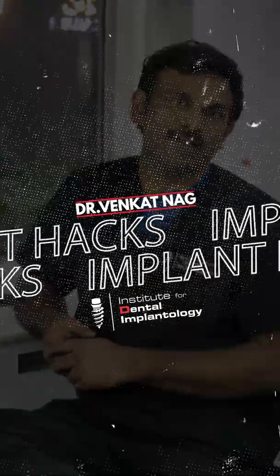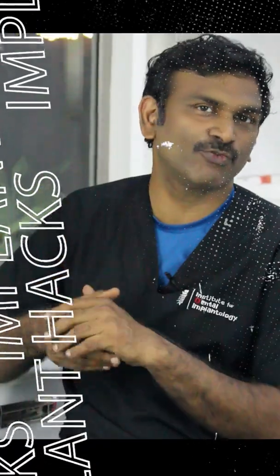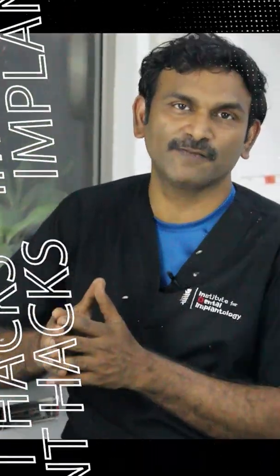Hi, this is Dr. Venkat Nag again. When we have full arch rehabilitations or full mouth rehabilitation cases, we often use graftless tilted implants. And once the surgical phase is done, we come to the prosthetic phase.